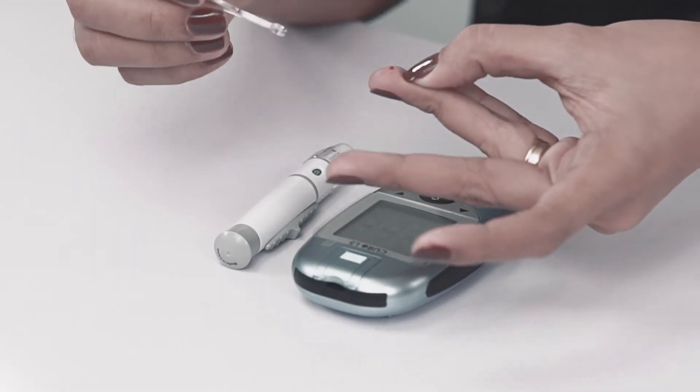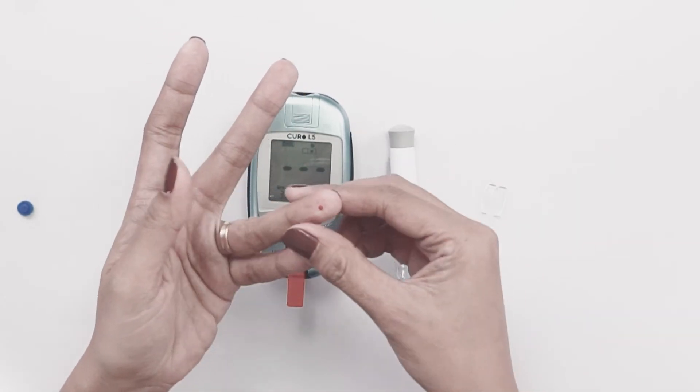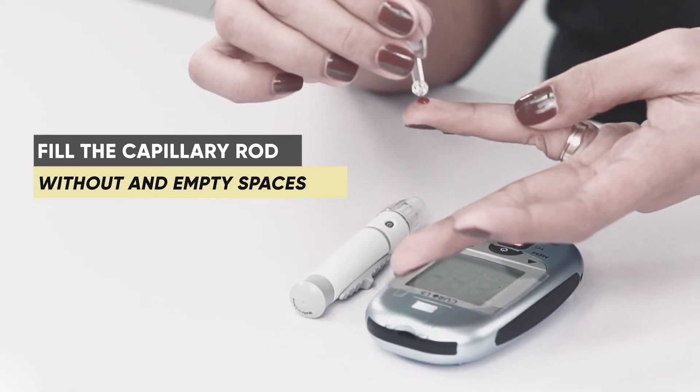Use the capillary rod to collect blood at a 90 degree angle. The blood will travel upwards via capillary action. The blood sample must fill the capillary rod collection area.